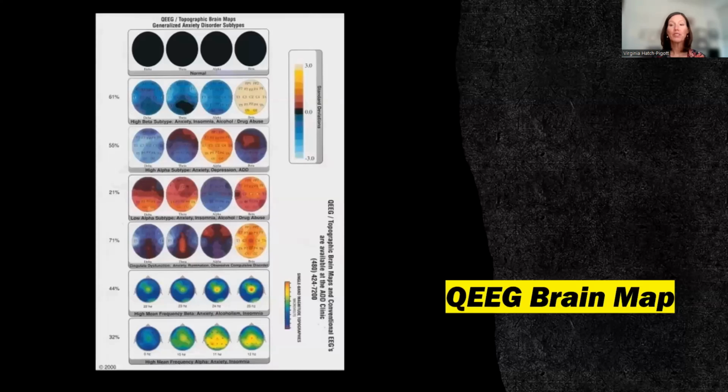Okay, well, those tables are amazing, but nowhere near as powerful as a color graph. Our databases take those tables and convert them into a color graph. So the top 5 rows that you see here are from a database called NXLink that was developed by E. Roy John, PhD, which you heard about in previous lectures.